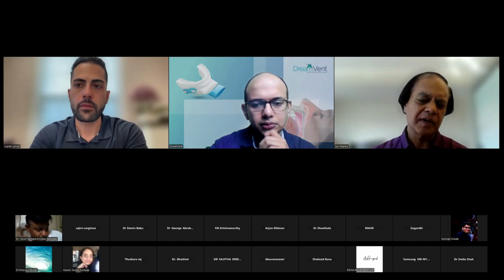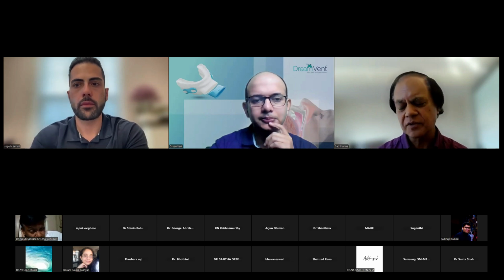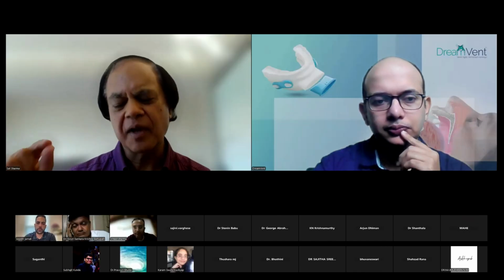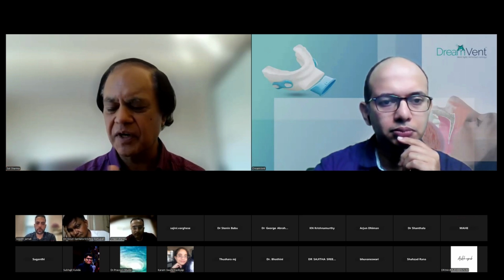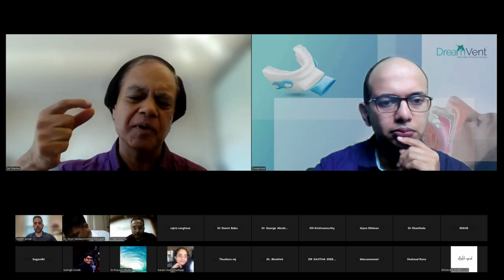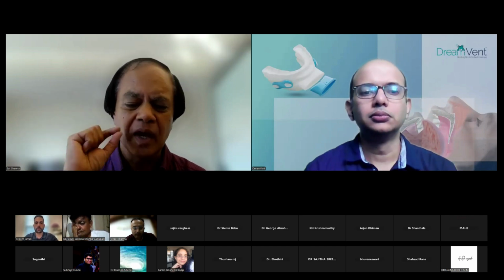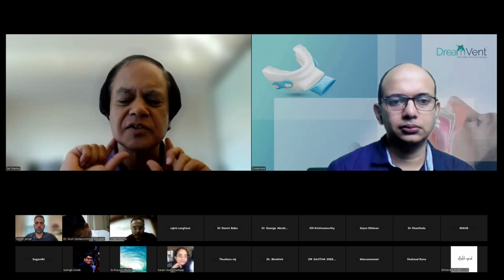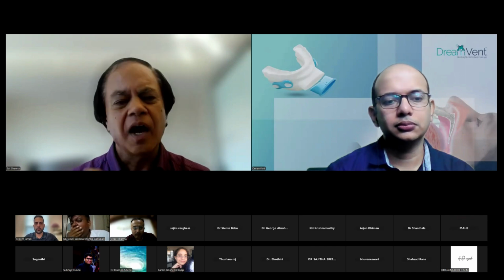Is CPAP more effective or oral appliance more effective? So my answer to them is that CPAP is definitely slightly more effective if you do a direct comparison, because with CPAP you can titrate up the pressure and you can treat all apneas. With an appliance, you cannot just keep moving the jaw forward. There's going to be a limit.